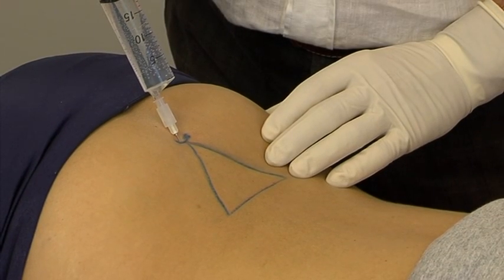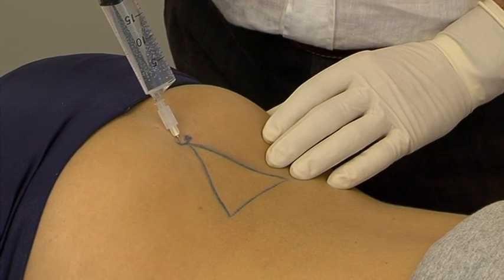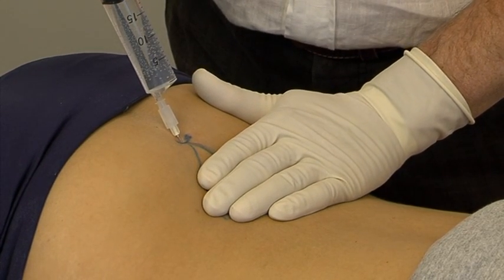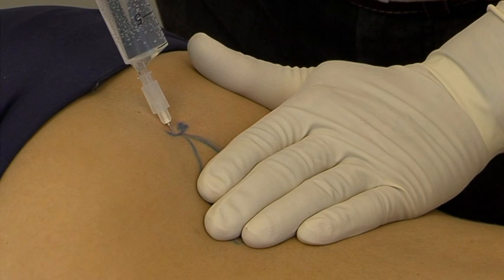The syringe with 20 ml procaine 0.5% is attached to the needle, and suction is applied to check for blood or cerebrospinal fluid. During the injection, one should keep the free hand flat on the patient's sacrum in order to detect a possible extrasacral injection.